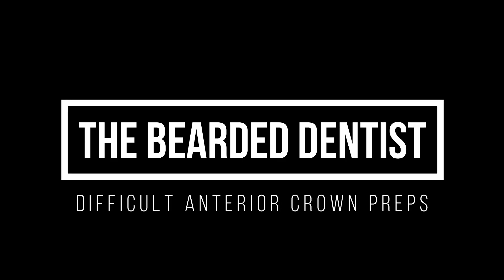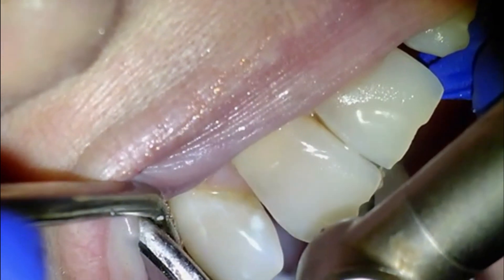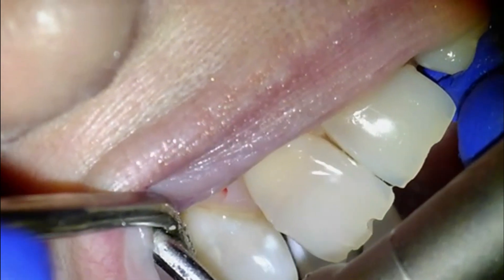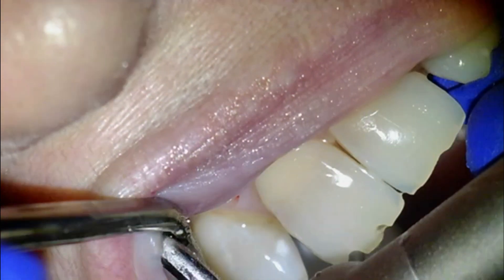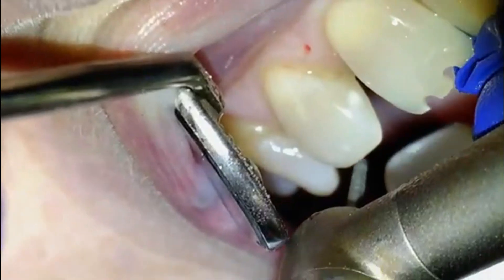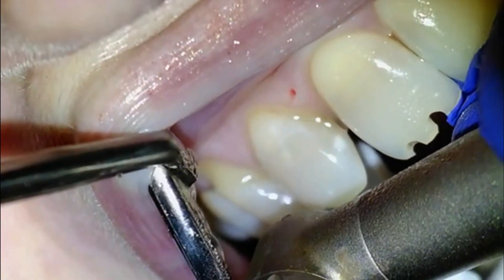Hello, and welcome to the Bearded Dentist. Today we will be doing some very difficult anterior crown preps on teeth 6, 7, and 8. This patient has a severe amount of acid erosion on the backs of all of her anterior teeth. The lower incisors are very intimately pressed up against the backs of these teeth when she's in full occlusion, making this an extremely difficult series of crown preps.